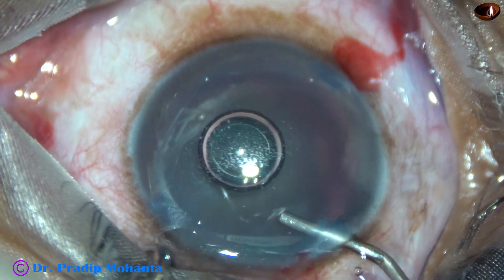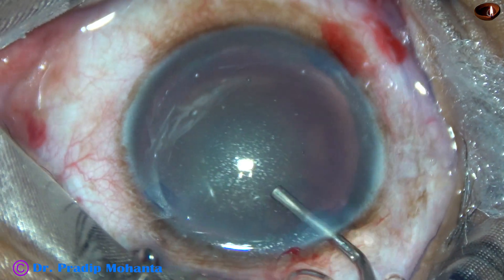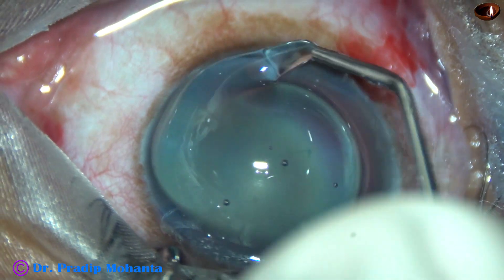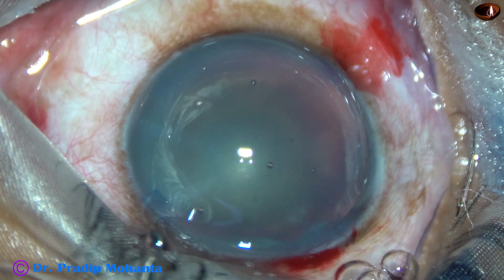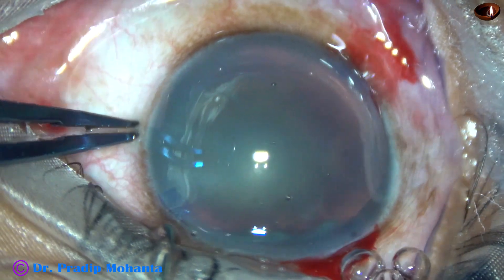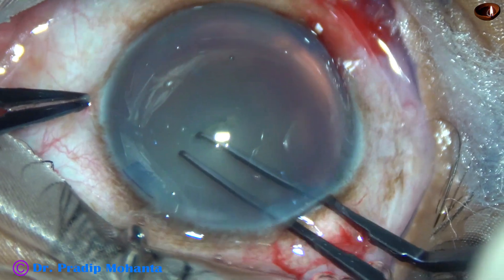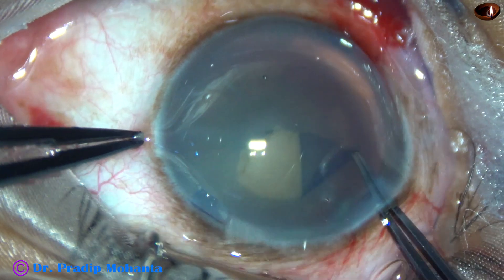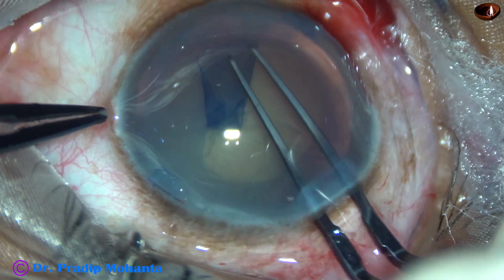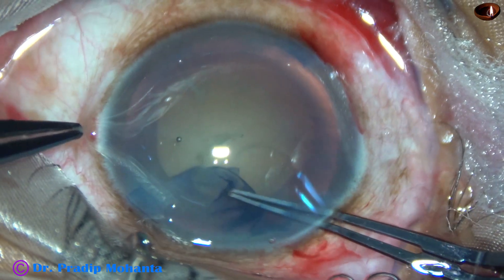Now this is 2% HPMC filling up the anterior chamber, and it is applied over the cornea for better visibility. Now I am going to use a utrata forceps for capsular access. The utrata forceps goes in, the anterior capsule is torn, and a capsular tag is raised. This capsular tag is guided anticlockwise to do a continuous curvilinear capsulorrhexis.